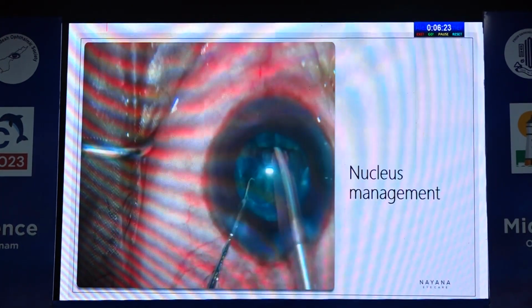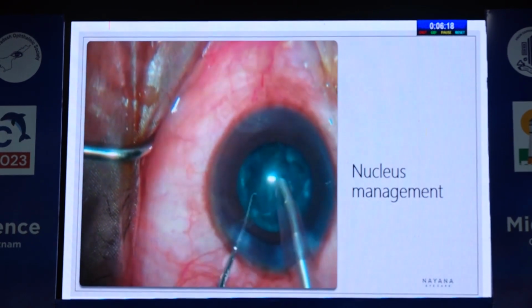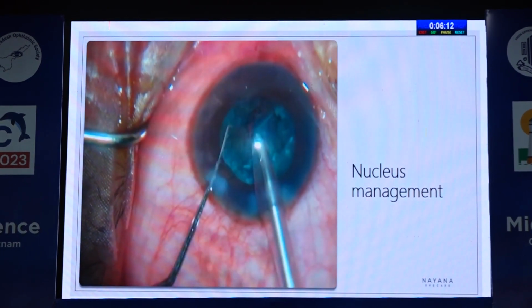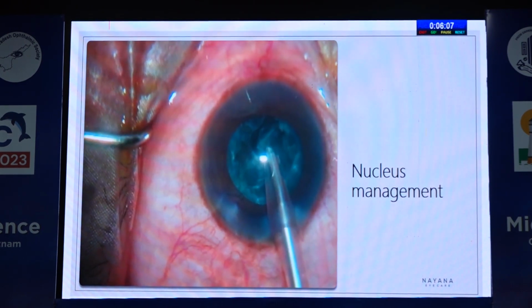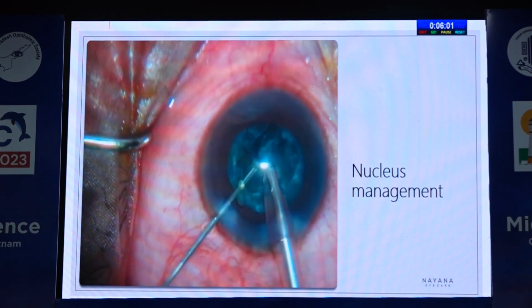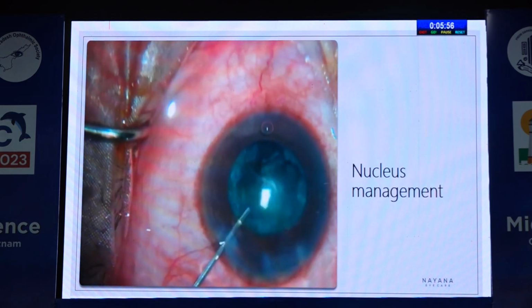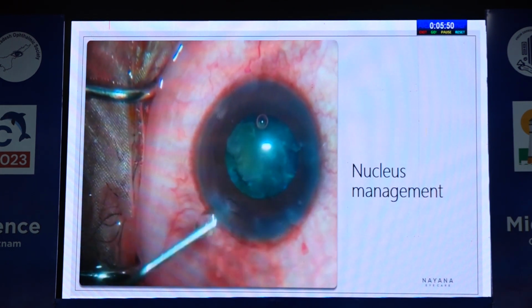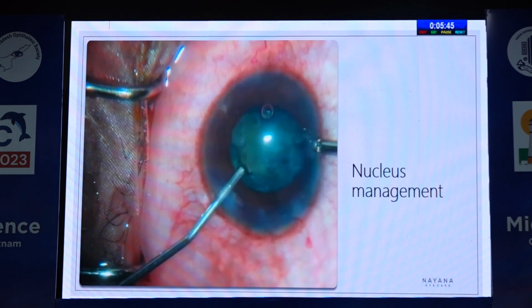Please observe carefully. There you go. Momentary dilatation of the pupil with sudden appearance of red reflex, which says that we have created a rent successfully. At this point of time, what most people do is retract the phacoprobe and everything outside the eye, which creates negative pressure and prolapse of vitreous in the anterior chamber. We have to retain the phacoprobe inside the eye and put a dispersive OVD.